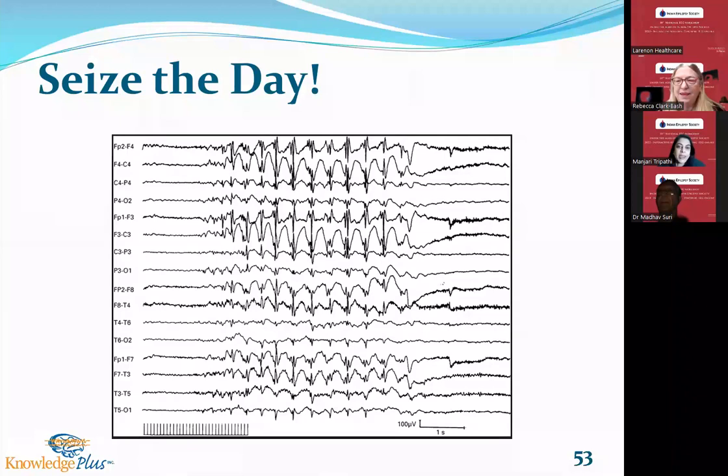Yeah. So there's another interesting question. Why do we consider the background only in the posterior dominant rhythm? Why not the frontal or other regions? This is by Dr. Iqbal. So each frequency band has a predominance. For instance, beta, frequencies faster than 13 and above, that's dominant in the frontals. And sometimes newer readers say, I don't see it. Well, it's usually very tiny amplitude, but beta is dominant in the frontals.